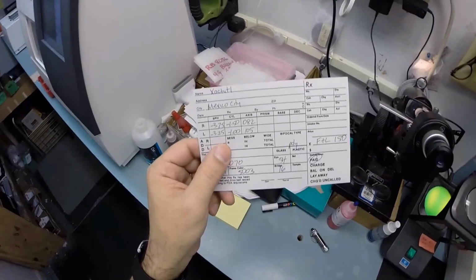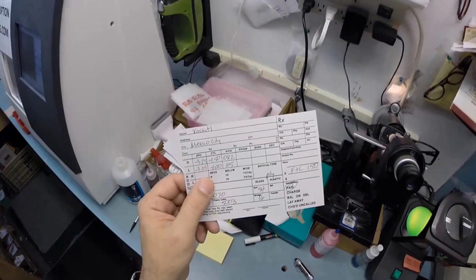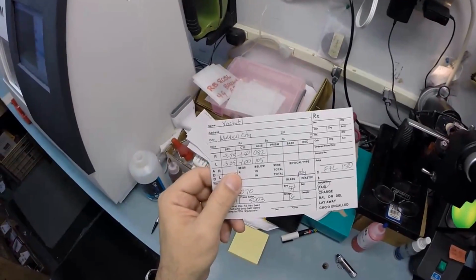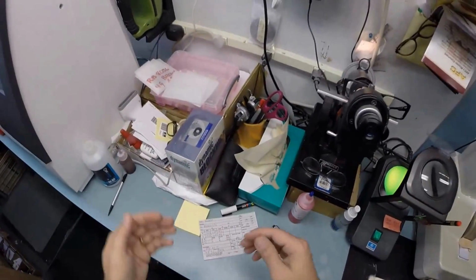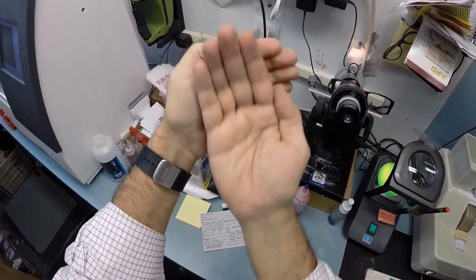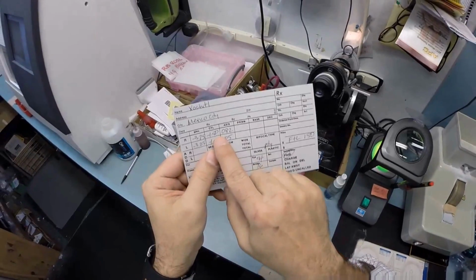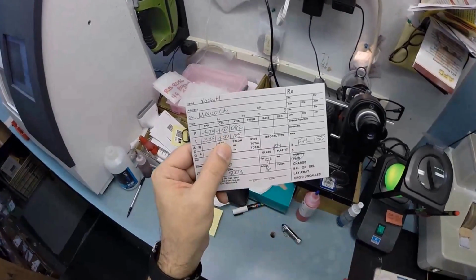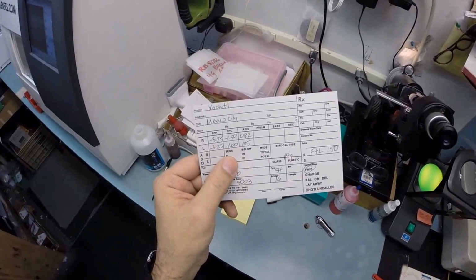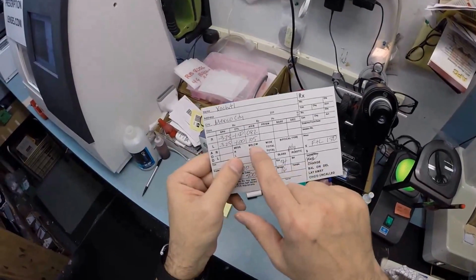Now there is a stigma over the word astigmatism. Astigmatism just means shape. It's like toric as well for contact lenses. You have 2 curvatures on your eye. One curve going this way, which is minus 375, and a second curve going this way, which is in another 6 steps, which is minus 150. Now, again, it's a shape. It's like saying someone has straight hair, someone else has curly hair. It is not a disease. It is not an affliction. It comes and goes, it fluctuates.